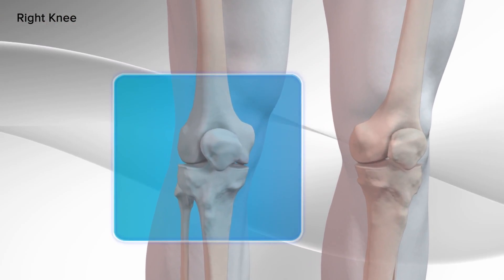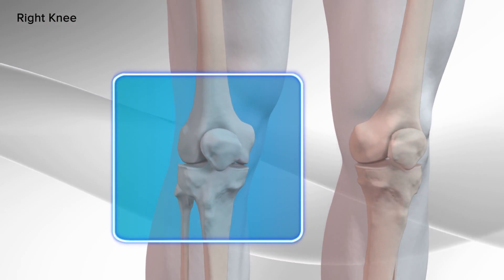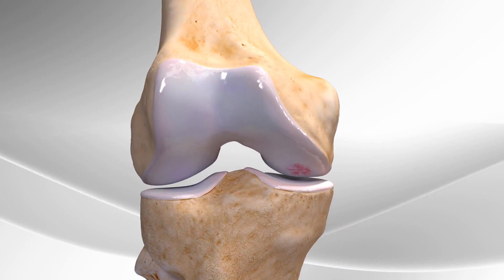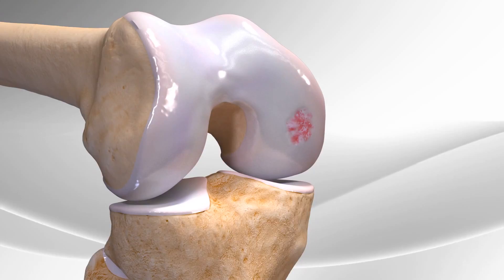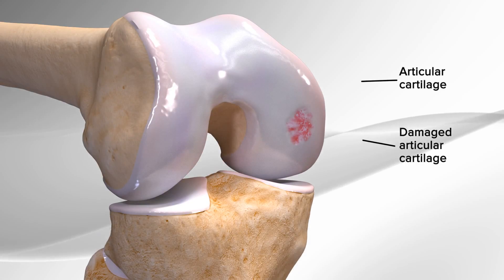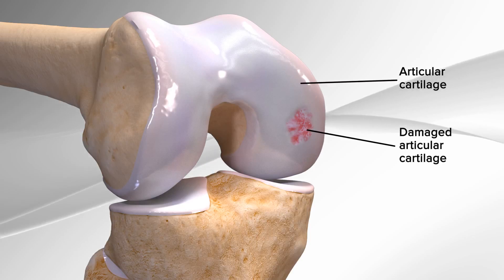Demonstrating the repair of damaged articular cartilage in the knee using biocartilage extracellular matrix. This technique is used to repair the smooth, eggshell-type tissue that covers the ends of the bones, also known as articular cartilage. It helps the bones to easily glide over each other.